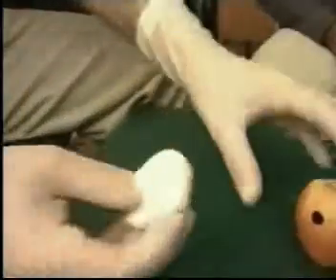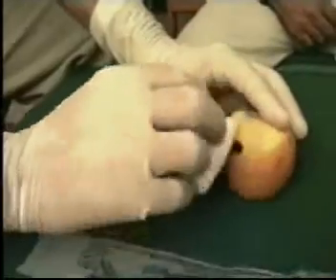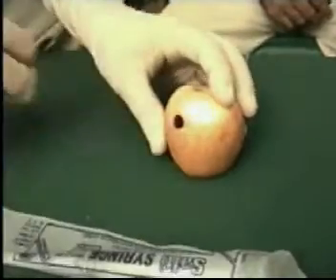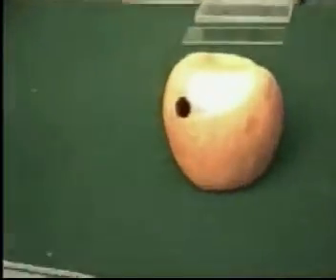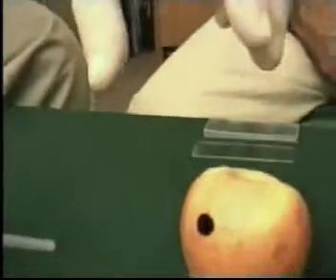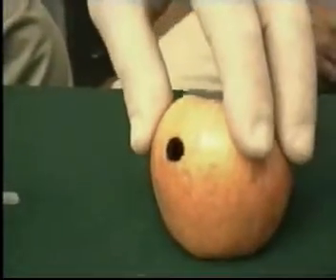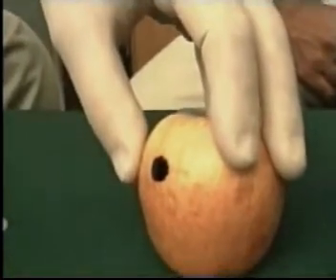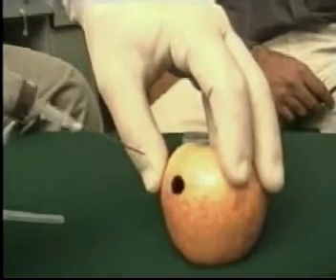The first step: the operator should be wearing sterilized gloves. With the spirit swab, clean the area where you are supposed to perform the fine needle aspiration cytology. Once cleaned, take up the syringe, remove the cap, and hold the growth or organ with your left hand.